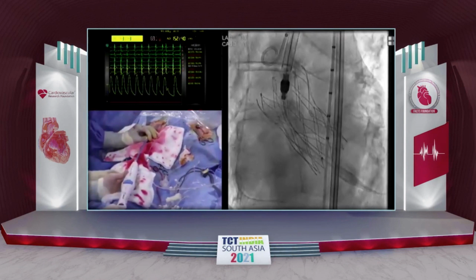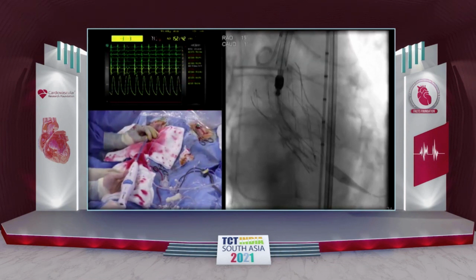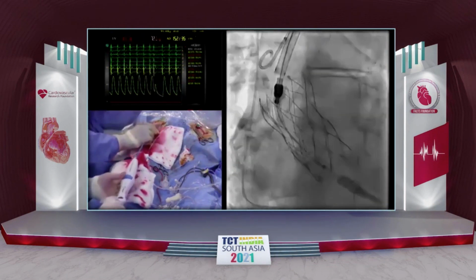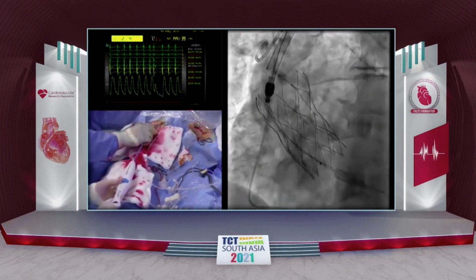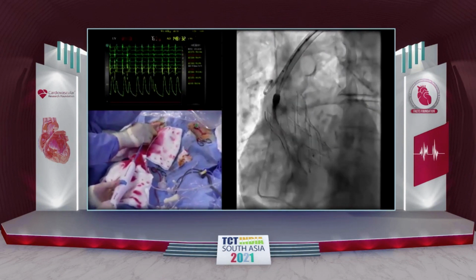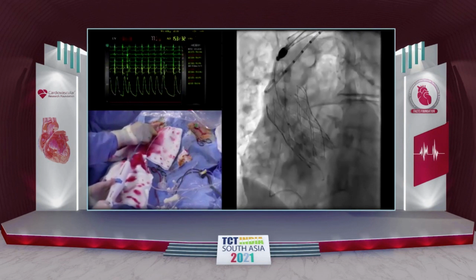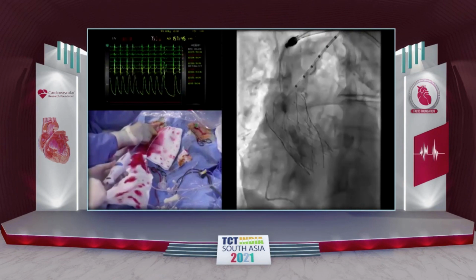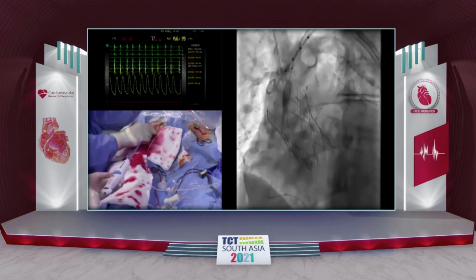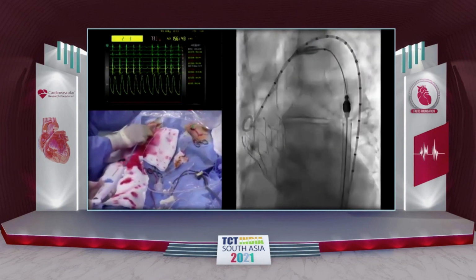Coupling off. So you can see all 3 anchors freely. I'm going to now gently go back to LAO and withdraw the delivery system. One of the things to remember with the Navitor system is that the upper crown cells at the outflow portion are also large, so you do need to make sure the nose cone does not interact with that. You notice I've also taken the wire out early on in the system. Okay, back to AP and off mag.